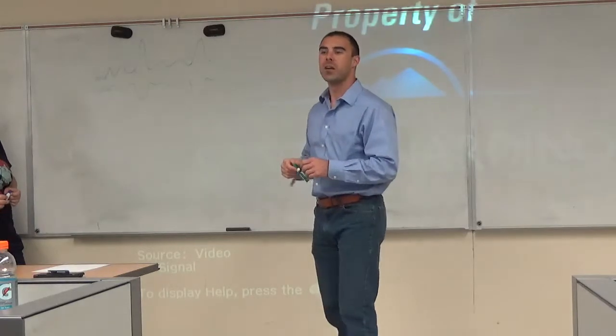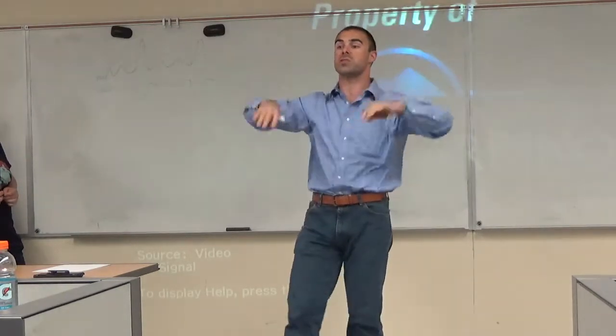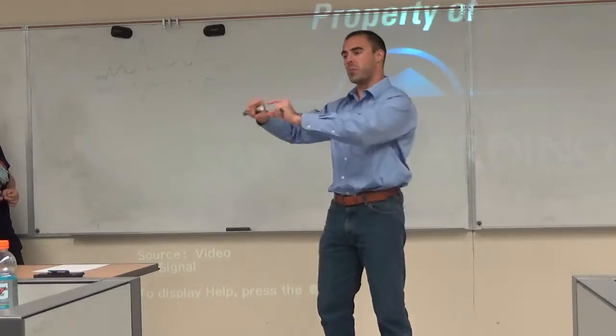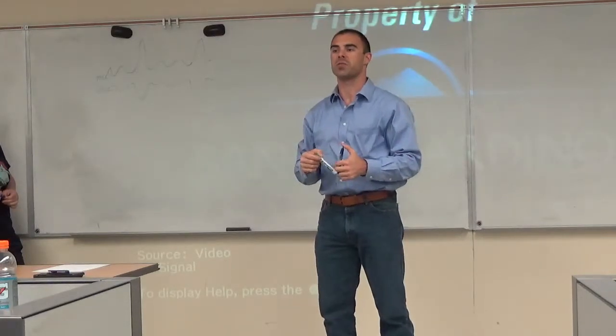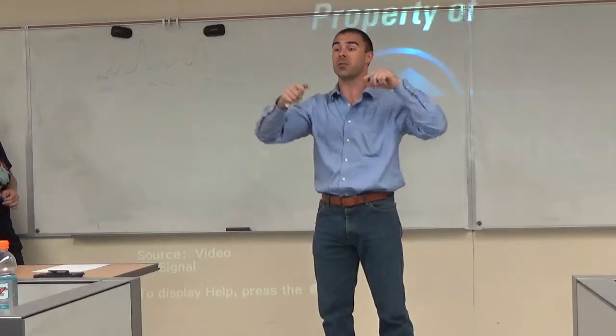What does VEOG mean? Actually, we did talk about it when we looked at those big screens of EEG going all the way across the screen. We said there's labels, and remember we talked about the 10-20 system? And then we said, what are these bottom electrodes where we can see the eye blinks? And we said there was vertical electrooculograms, and then there's also the horizontal ones. Remember? It's like the saccade over there. Yeah, exactly.